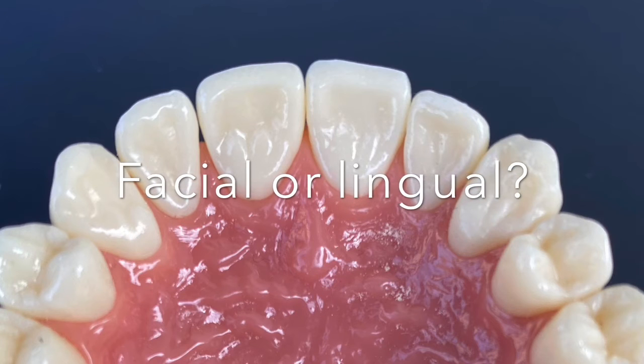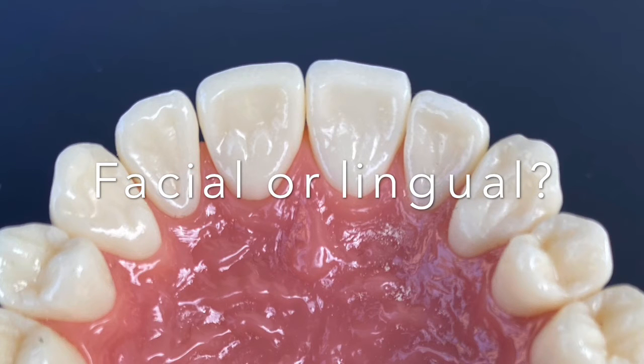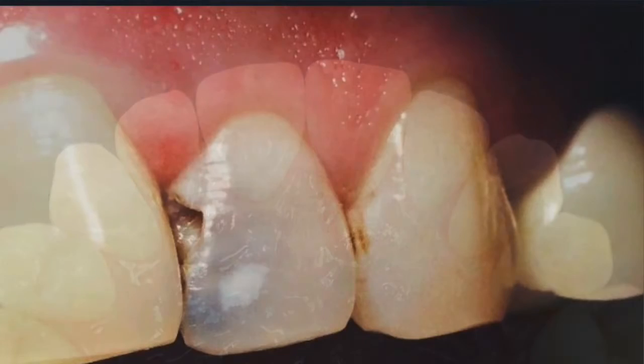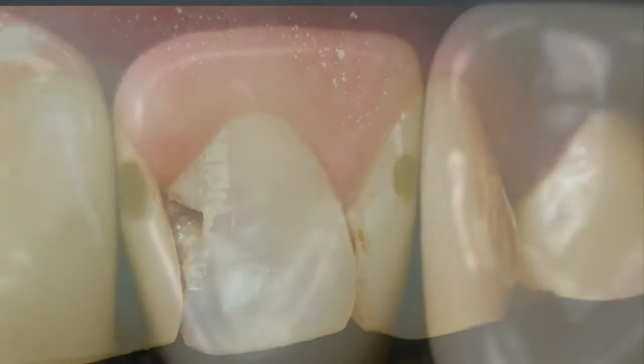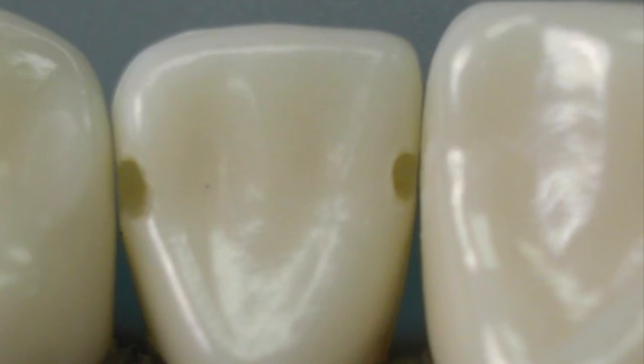In preclinic, you will always access your class 3 preparation from the lingual. However, when you are working on a patient, you will have to make the decision on whether you will use a facial or a lingual access. A facial access will be acceptable if the carious lesion extends close to the facial or onto the facial, like the photo above. It is also acceptable if you are replacing an existing class 3 restoration that is on the facial that either has defective margins or recurrent decay. In all other cases, a lingual access is preferred.